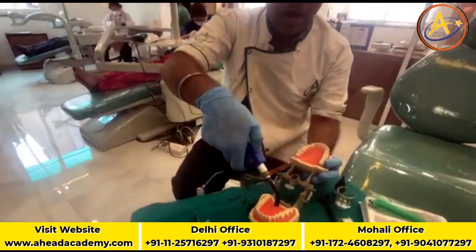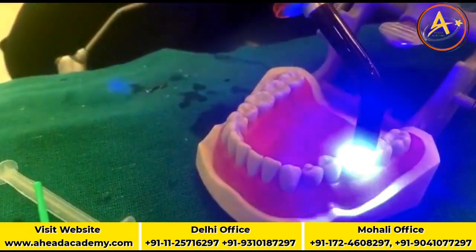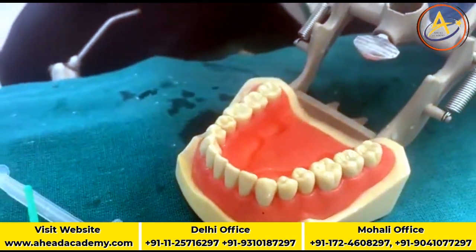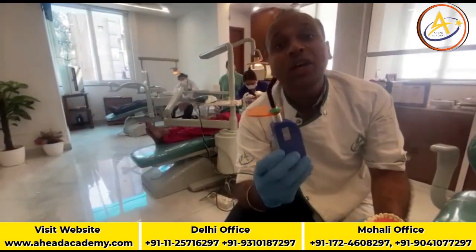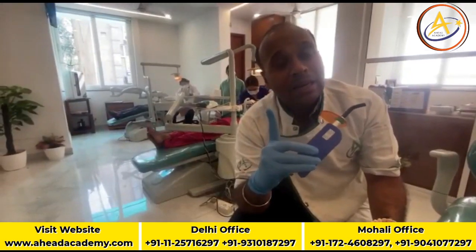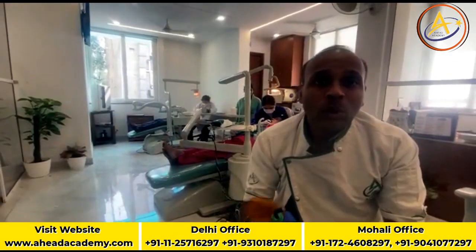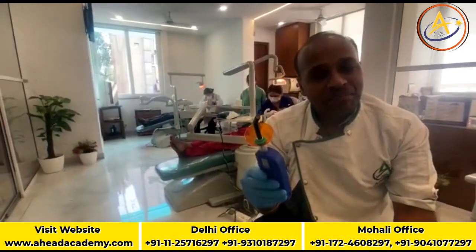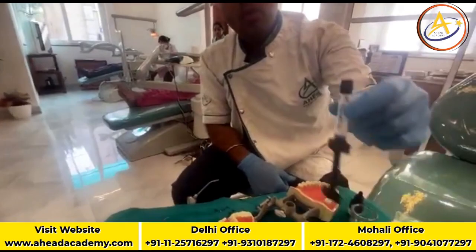Now, after drying of the tooth surface so that extra bonding agent is displaced, it's time to take your curing light and cure the bonding agent. Some of the operators ask me the question, sir, for how much time should I cure? I always say the answer may be 1 second or maybe 30 seconds. It all depends on the intensity of your curing light. In the market, there are curing lights available which can cure in just 1 second. Remember, in 1 second. And there are Chinese lights which require 20 seconds or maybe more than that. So when you're purchasing a curing light, just see. Fine.